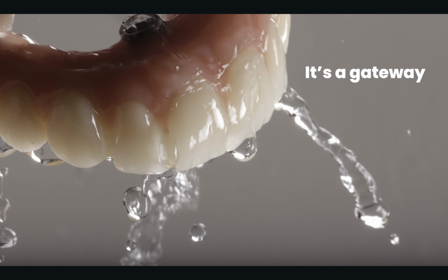And so for that reason, it's a really great avenue to get the groundwork down so the lab can then iterate and build upon it. The benefit is the orientations of the tooth files that you're placing in SmileCloud translate directly across to something like ExoCAD. I keep using ExoCAD as the example because that's my main one that I jump out into. And so 90% of the design is done. It's just finessing some of the smaller details in ExoCAD.